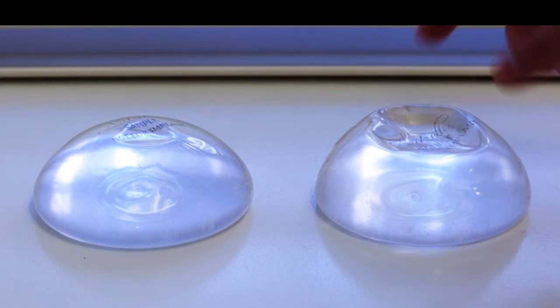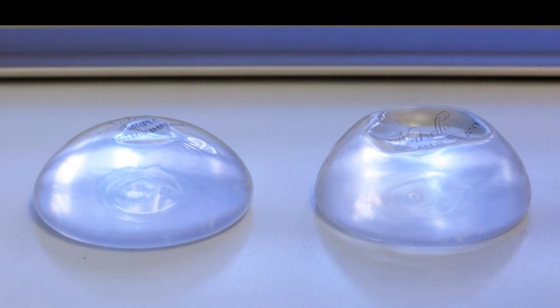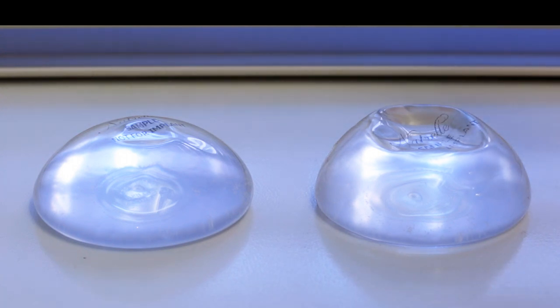You can see here that the shell of the regular implant kind of bows in itself on the top, and that's because the gel on the inside is a little bit softer. Both of these gel cores are solid, so they're both technically gummy bear implants.